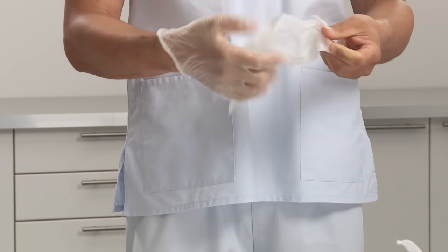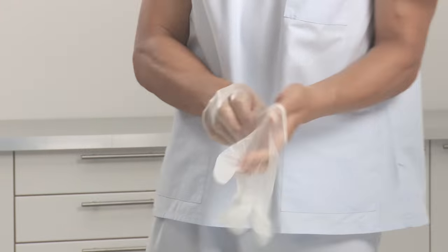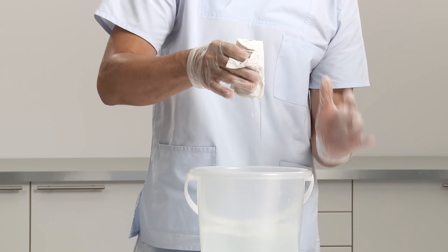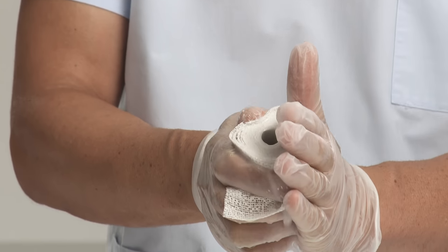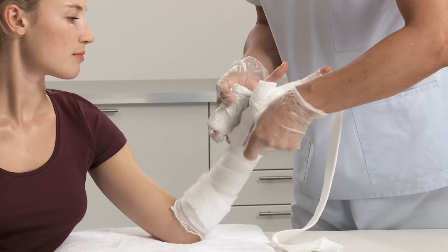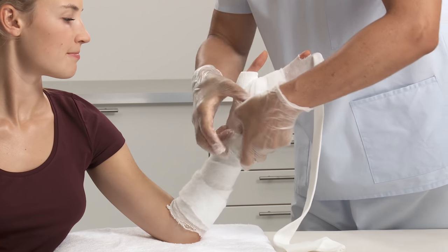It is recommended to wear protective gloves before applying the plaster of Paris cast. Select the appropriate width of the plaster of Paris bandage. Dip the bandage in cool water and let it soak, remove from water, let it drip and then gently squeeze to drain away any surplus water.